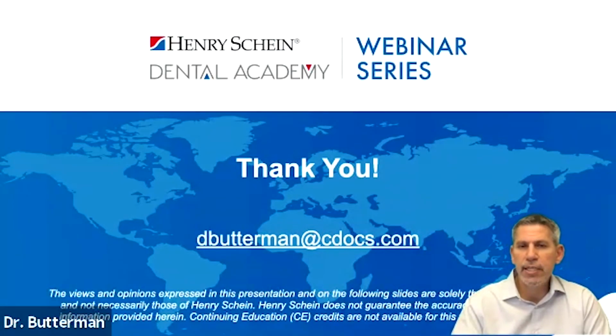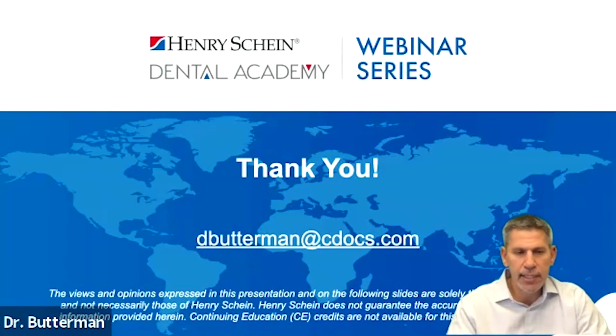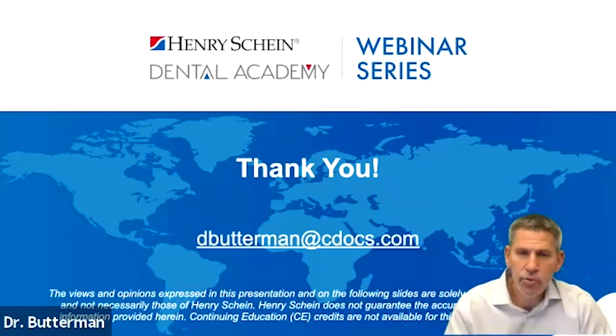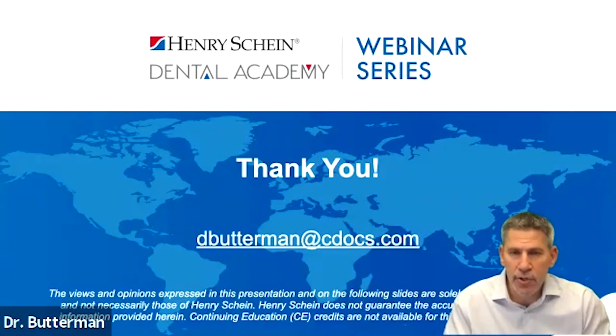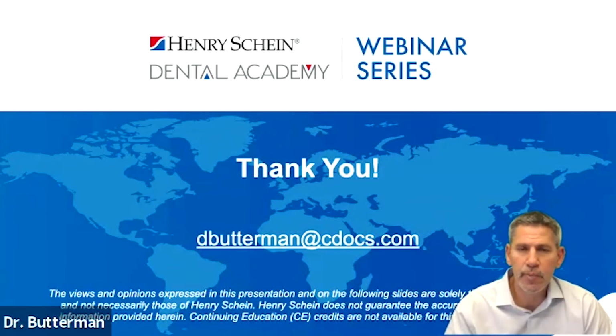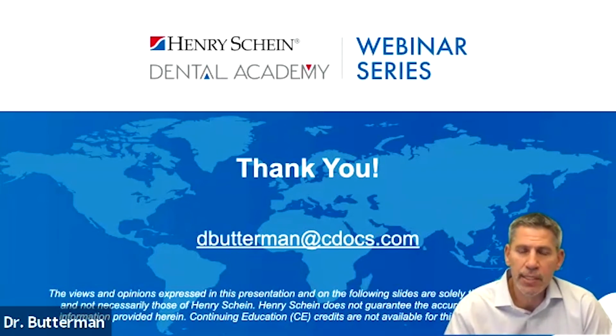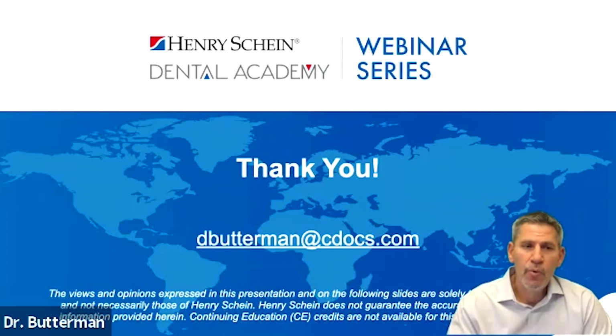So I would encourage you guys to take a look at this, and in the last couple minutes, if there are any questions, we can jump in. I would encourage you guys to reach out to Schein, reach out to your reps, take a look at the technology, because it's there now, and this is not the future. This is what's happening in dental practices around the globe, and it's just predictable, and just as importantly, it's fun. I love doing this kind of stuff, and it takes the pressure off. It makes it exciting. What questions?